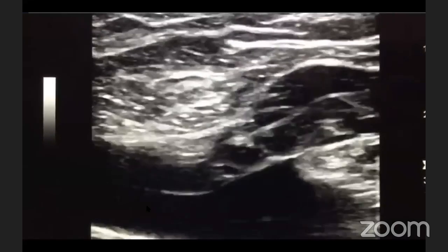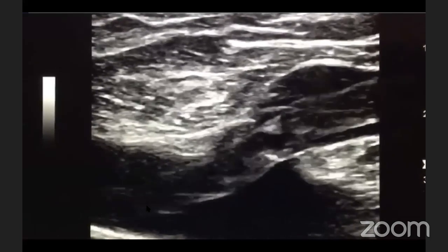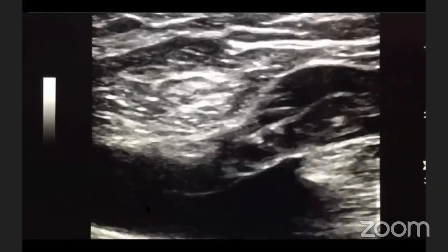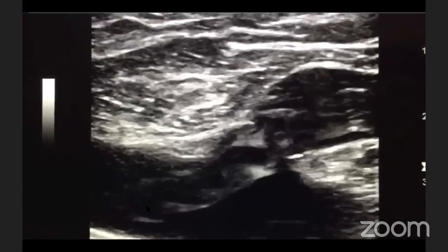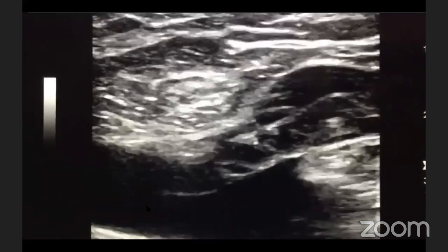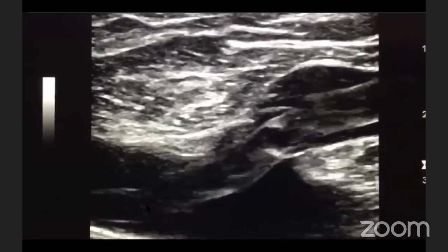This is a nasty short clip from the superficial system, looks like a subacute thrombus going into the deep system through one of the junctions. I'm not really sure if it's the saphenofemoral junction or saphenopopliteal junction. One of them, the valve gets damaged and the snaky thrombus here is traveling to the deep system.